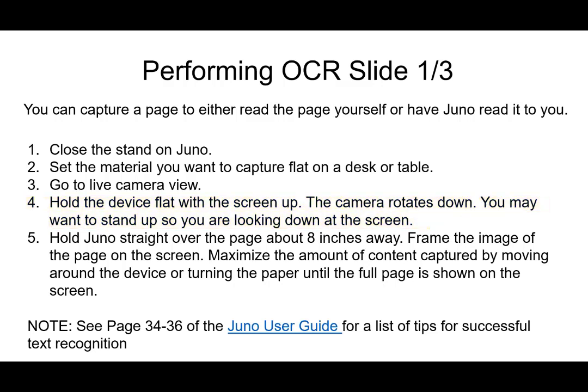You might want to stand up so that you're looking down at the screen. Another option is to put your elbows down and hold the device between your hands, but with a larger piece of paper you'll probably want to stand. Hold the Juno straight above the page about eight inches away, maybe a little more. Frame the image of the page in the screen and try to maximize the content captured — moving the device or turning the paper until the full page is shown. That's going to take a little bit of practice.